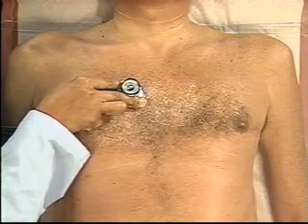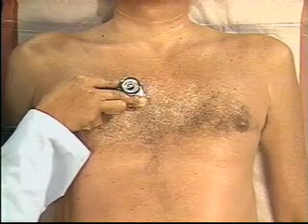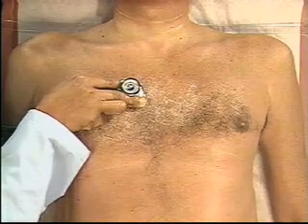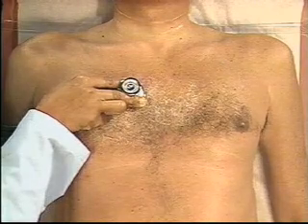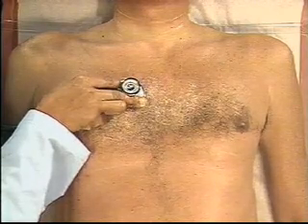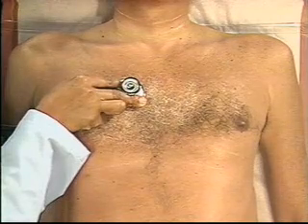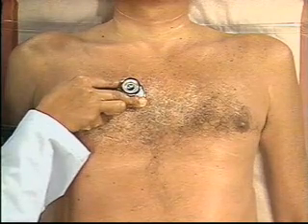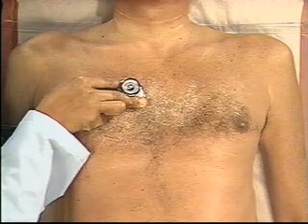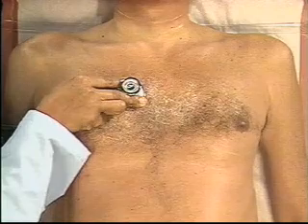Begin listening at the right second interspace close to the sternum. Note the cardiac rate and rhythm. Identify the first and second heart sounds and listen for extra heart sounds and murmurs.